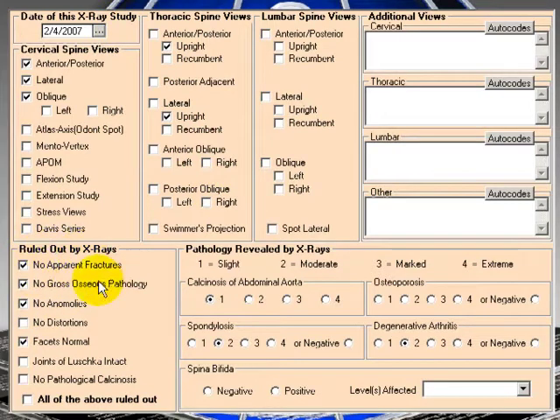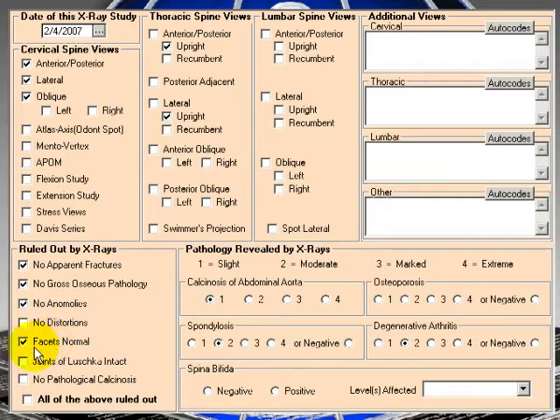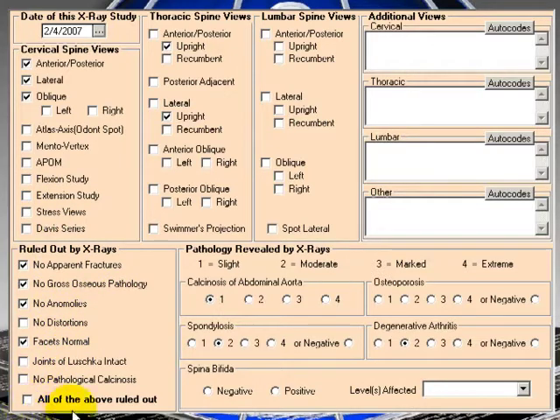Now, what's ruled out by x-rays? No apparent fractures, no gross osseous pathology, no anomalies, facets normal. If they're all ruled out, you could just put all the above ruled out.